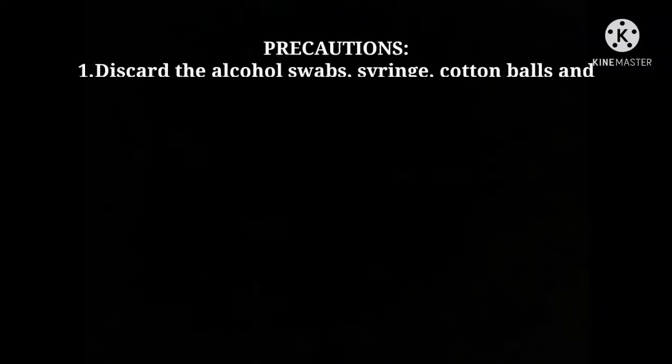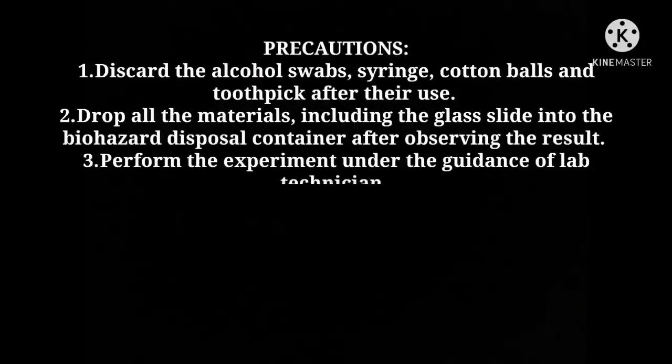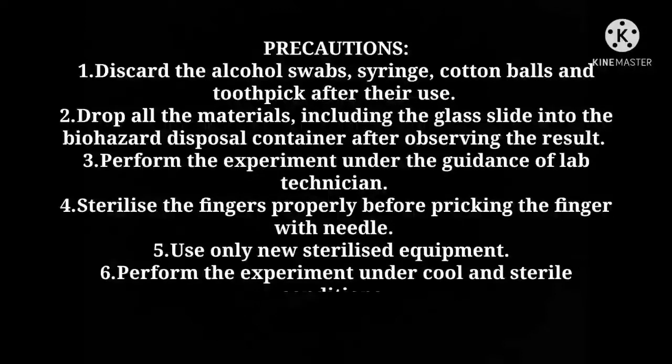Precautions: discard the alcohol swabs, syringe, cotton balls, and toothpicks after their use. Drop all the materials, including the glass slide, into the biohazard disposal container after observing the results. Perform the experiment under the guidance of a lab technician.